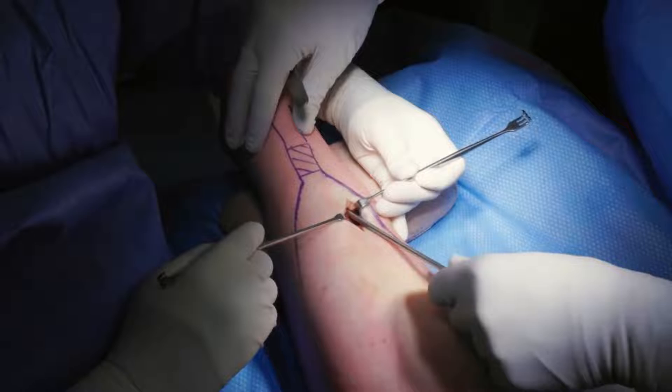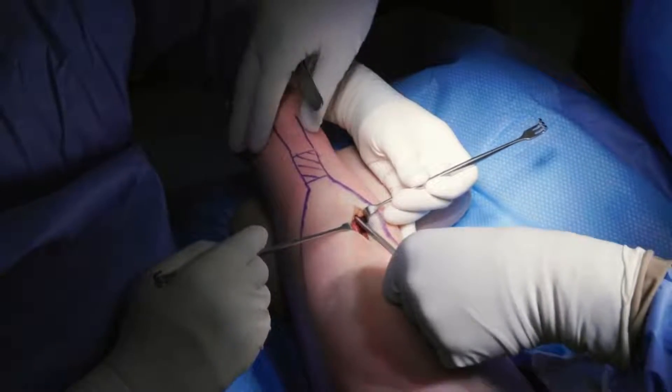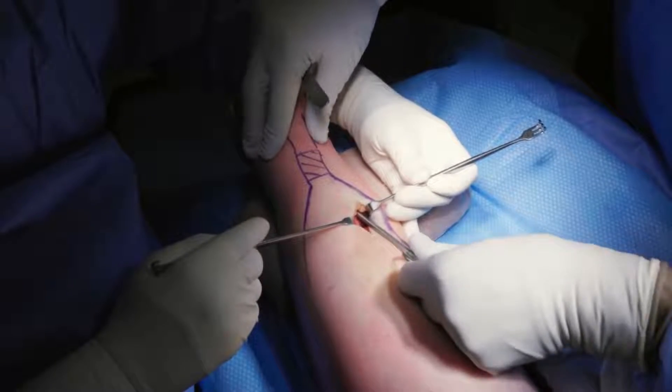Further dissection is performed with METS to extend the opening of the plane, moving distally alongside the Achilles tendon on both the medial and lateral sides.